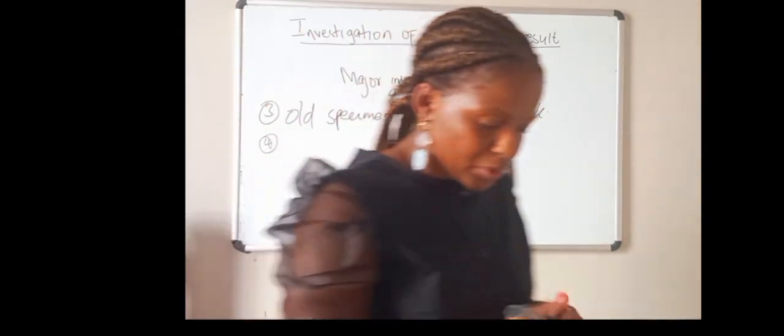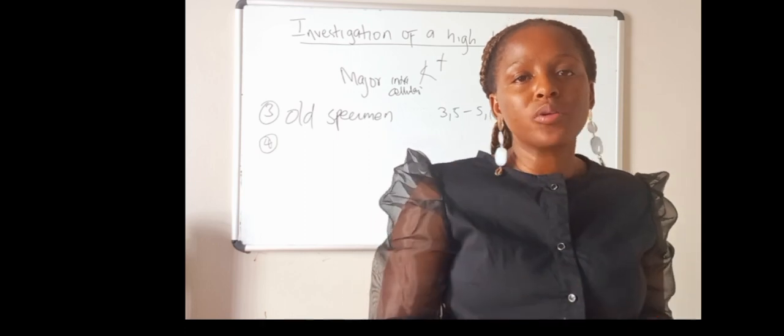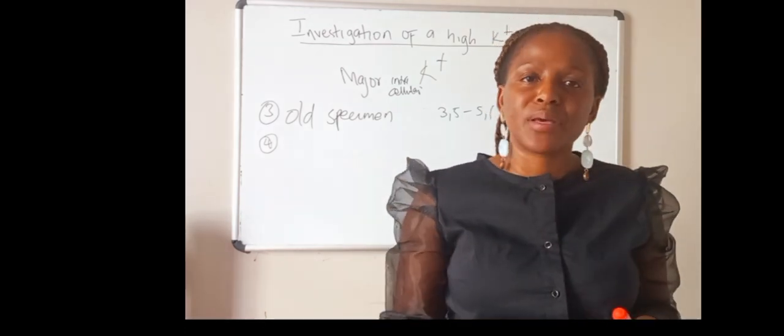So when I rule out that my specimen is not hemolyzed and not old, what you can look for as well is EDTA contamination.